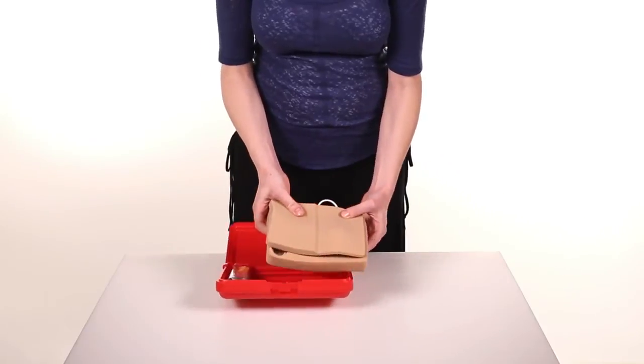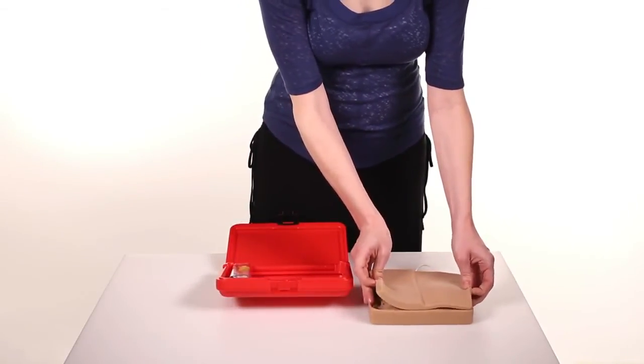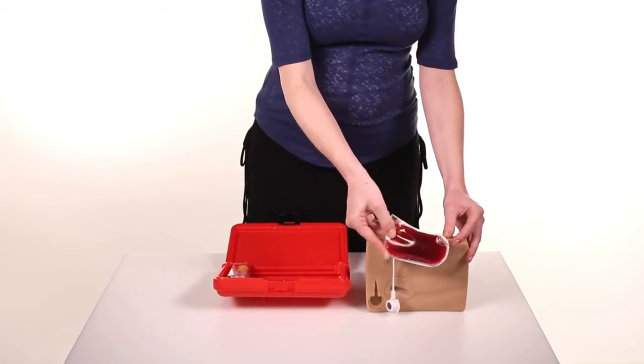The inserts are interchangeable and the model can be accessed in the case or removed from the case. The artificial blood bag is contained within the tissue block and normally does not need attention.